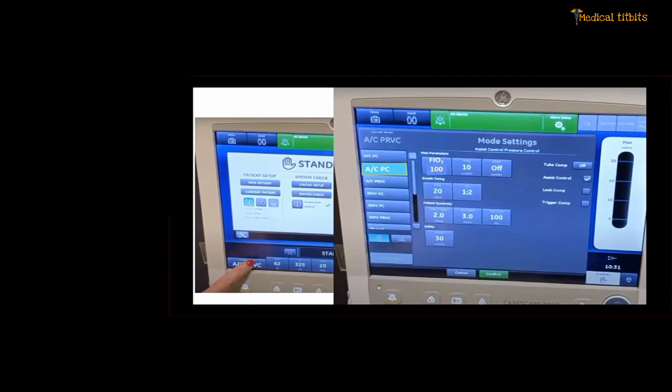I'll come down on FiO2 depending on either the blood gas values or the oxygen saturation on the monitor if the pleth is satisfactory. Empirically, I am trying to set an inspiratory pressure, or pressure control as we call in some ventilators, as 10 centimeters of water. I'm going to set a PEEP of 8. Usually we set around 3 to 5 centimeters of water, which we think of as a physiological PEEP, and with positive pressure ventilation we keep usually a minimum of 5 centimeters of water.